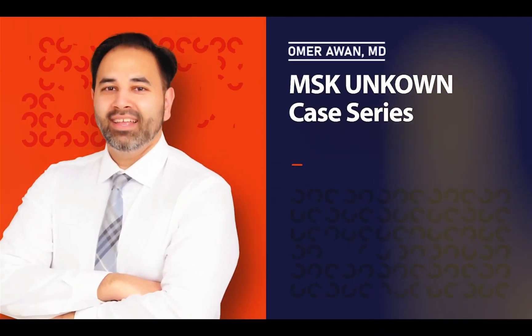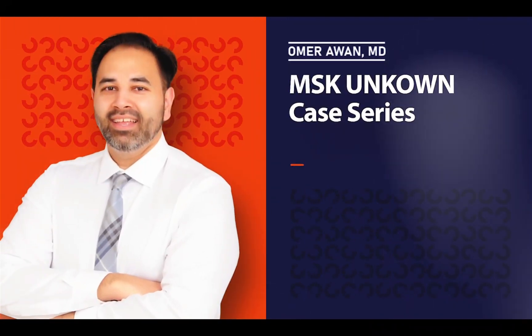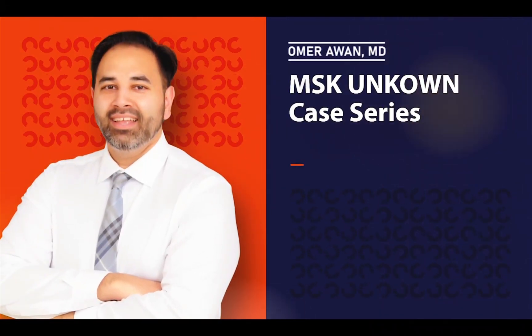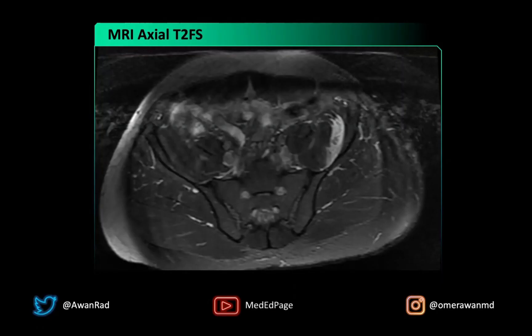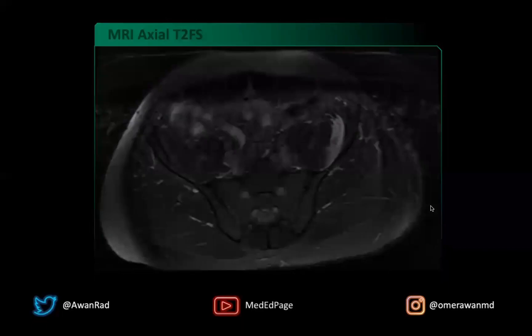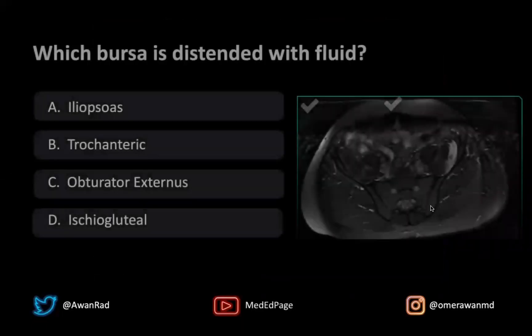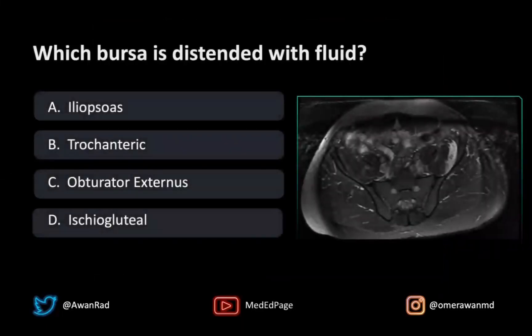Hello and welcome to MSK Unknown Case 89. This is an MRI axial T2 fat sat image through the pelvis. The high yield question we have for you is: which bursa is distended with fluid? Is it the iliopsoas bursa, the trochanteric bursa, the obturator externus bursa, or the ischiogluteal bursa?